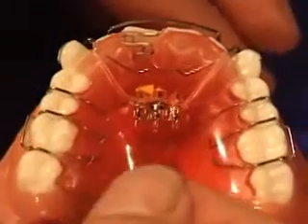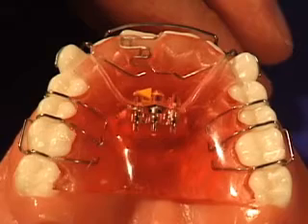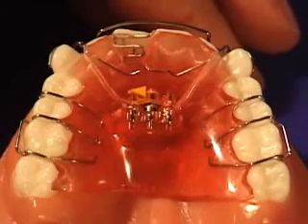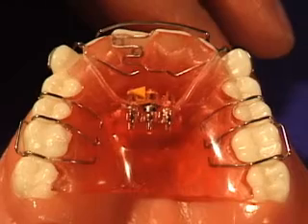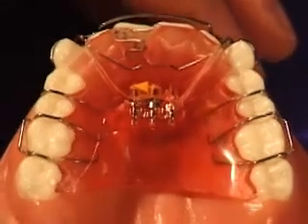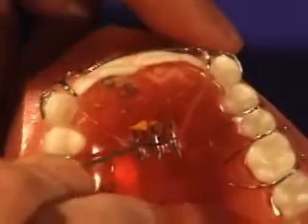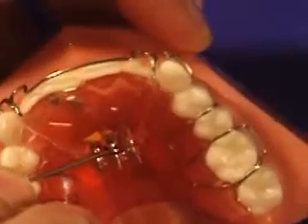Removable appliances with expansion screws are self-limiting. If the patient over-extends the screw, turns it too rapidly, or is not wearing it, the appliance simply will not fit in the patient's mouth, as is demonstrated here. The acrylic will lay high, the clasp will not seat down, and often the appliance will just flop out of the patient's mouth.